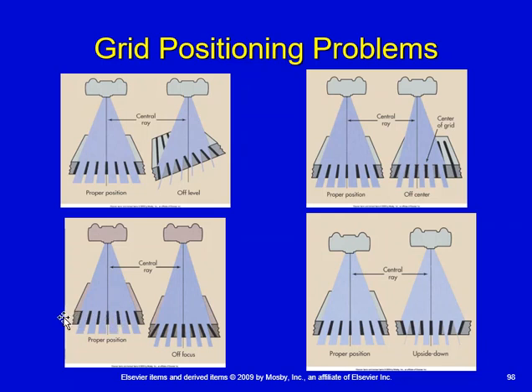So if we cut the grid in half this way, and thereby make it half as tall, then going back to the formula, the grid ratio is the height of the grid strips divided by the distance in between. What we're going to do is effectively halve the grid ratio, and our cleanup would go down.